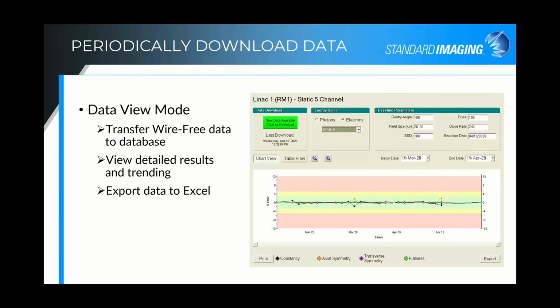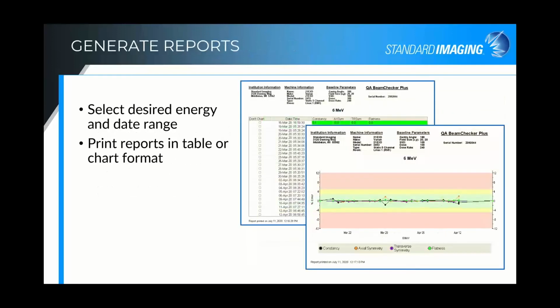And that could be the only time you need the software, if you want to take a look at the trending. But if you do want to use the software, this is actually, I'm sorry, the reports being generated. So these are the reports you can generate, either in the linear chart view or the tabular view of the actual readouts and results on a daily basis, as you can see. So you can print those or save those as you see fit.